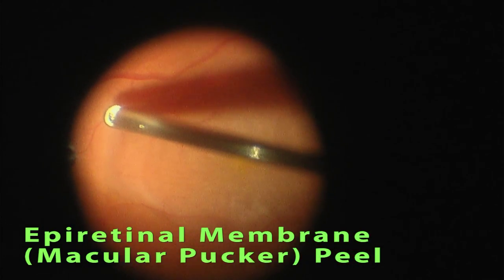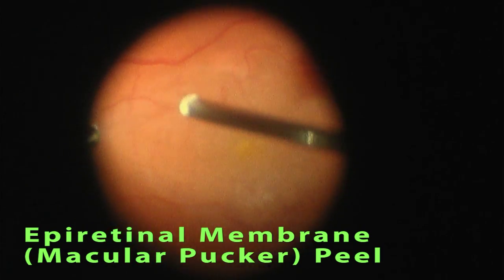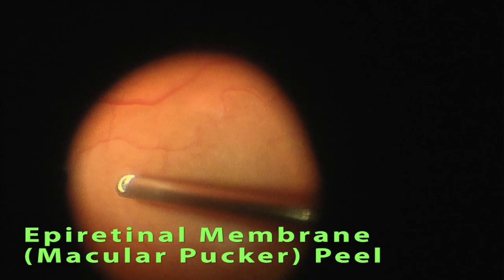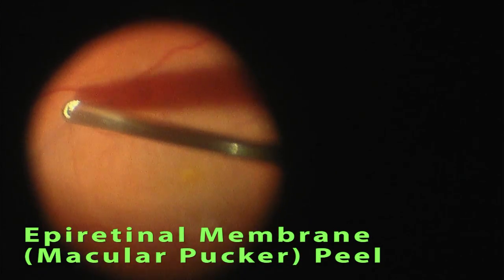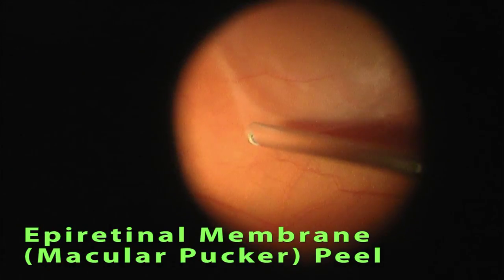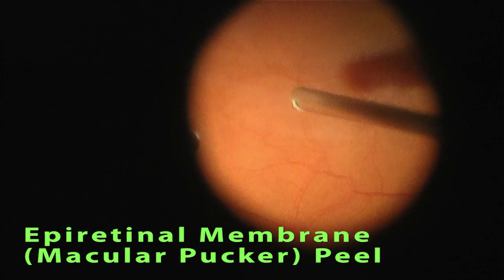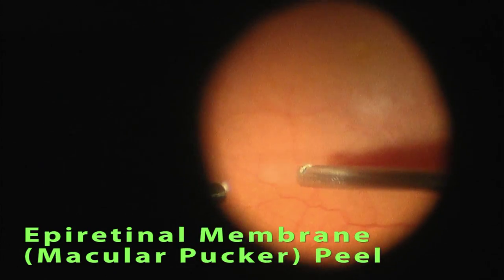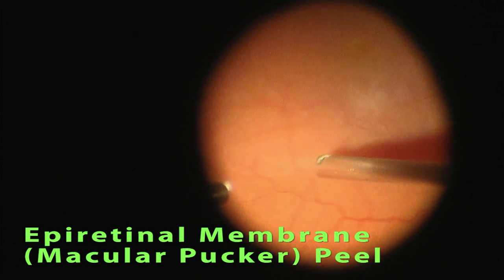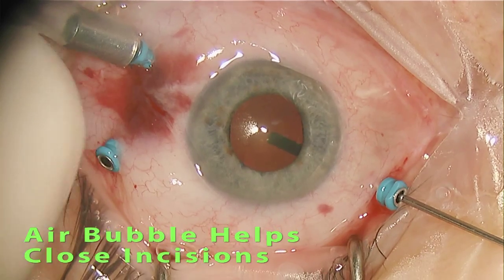This macular pucker was particularly delicate and the forceps was tearing it a little bit, so I used the vitrectomy probe and the suction to pull the macular pucker toward the periphery of the macula. Once the macular pucker was far away from the center of the macula, I used the vitrectomy probe to cut it back rather than trying to tear it away. Here you see the probe being turned and used to cut back the macular pucker, very far from the center of the macula.